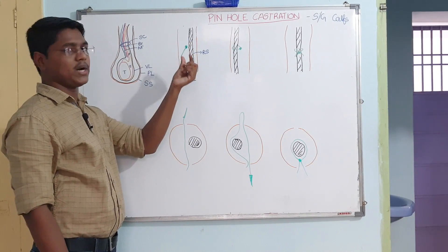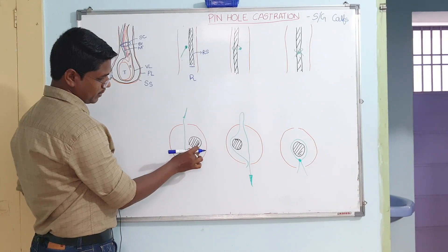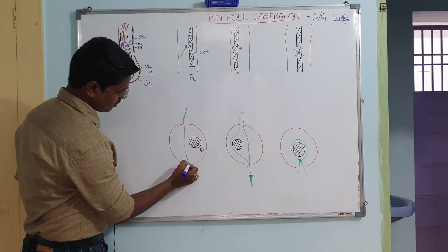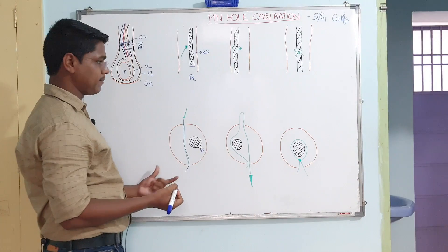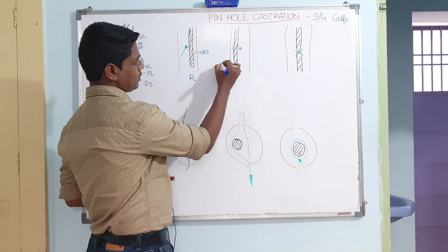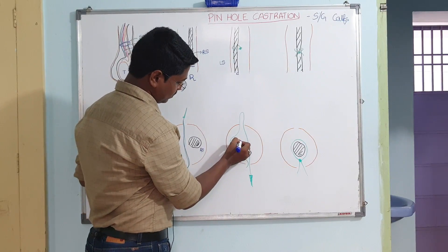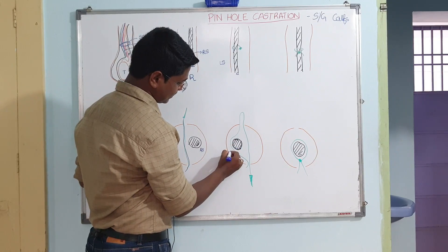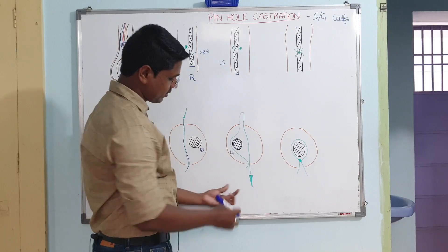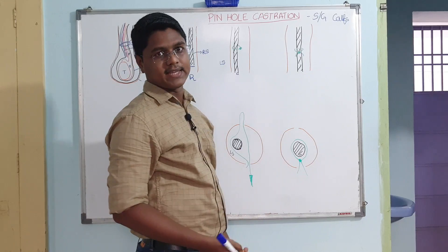You can easily find this spermatic cord. Push it to the right side, then make a through-and-through hole — understand this in dorsal view. You have put the spermatic cord to the right side and made a through-and-through hole. Next, put the spermatic cord to the left side and bring the needle back through the same hole — not another hole, the same hole.